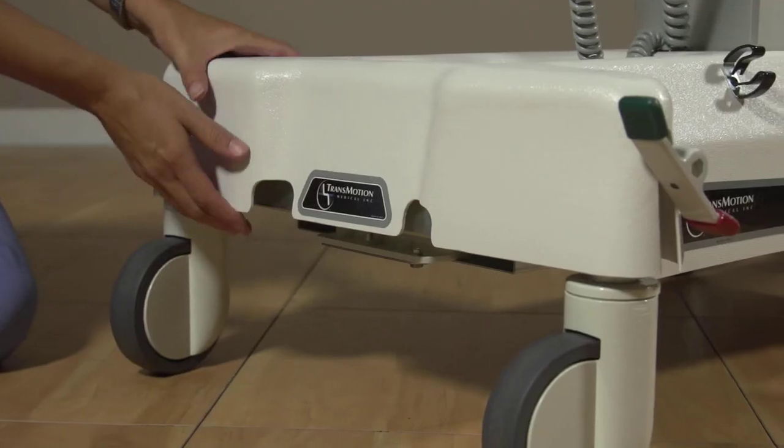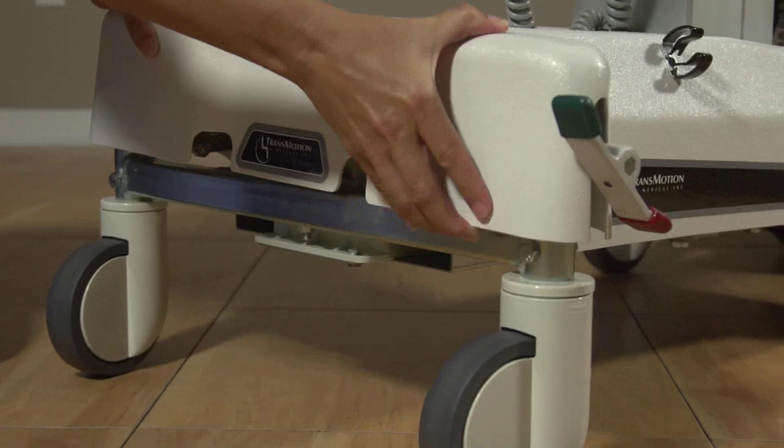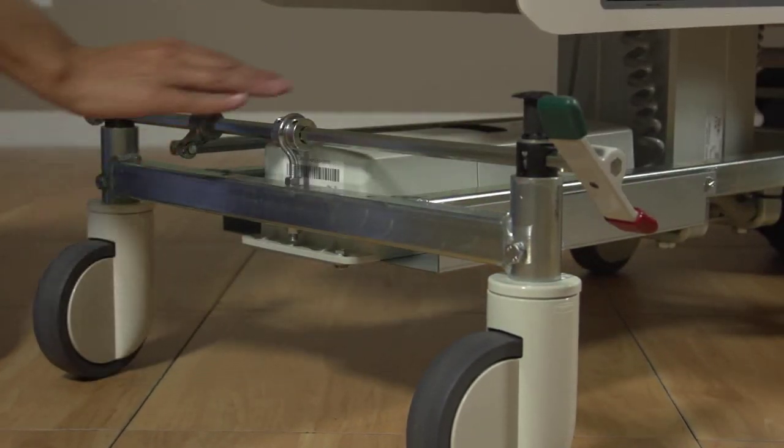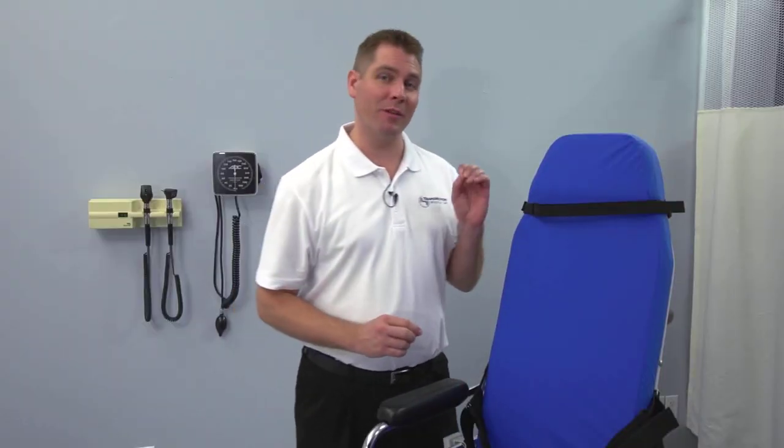One of the things you'll love about your TransMotion Medical chair is its low maintenance. The battery, the pendant, and the actuators all plug into a central control box located under the base cover. This means that replacement of any of these components will only take minutes. Your chair operations manual will give you all the details.